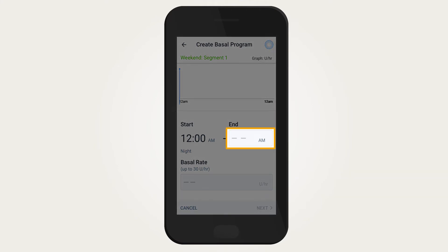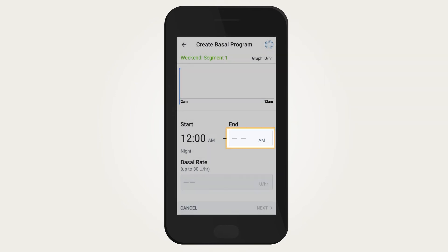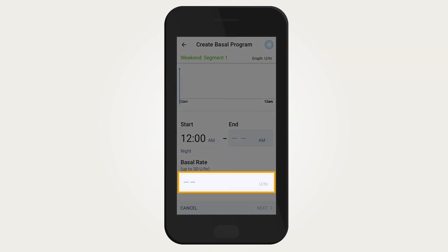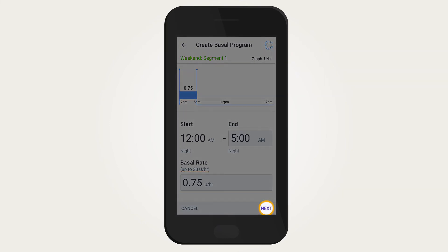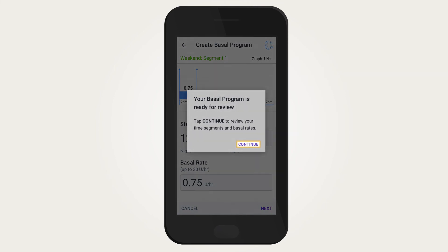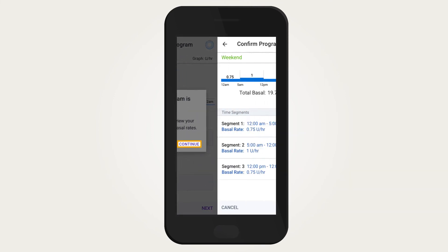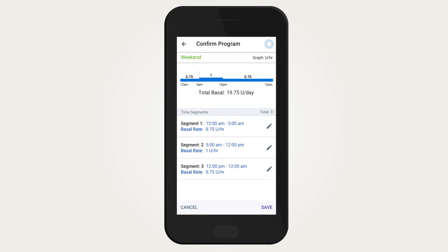The first basal segment always starts at midnight. Tap the end time field and select the time the first segment should end. Tap the basal rate field and scroll to select the basal rate, then tap Next.